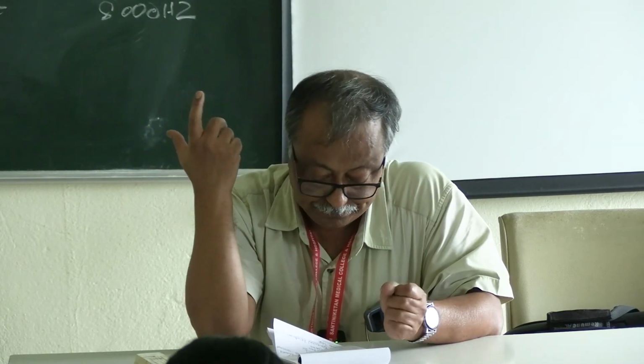Similarly, there is a notch in another pathology, but the deafness type is different. That is a sensorineural hearing loss, and there is a notch or a dip at 4000 Hz, that is acoustic blast trauma or acoustic trauma. That may be a very short question: a notch at 4000 Hz in pure tone audiometry. Diagnosis 1, 2, 3, 4. The MCQ question can be given.